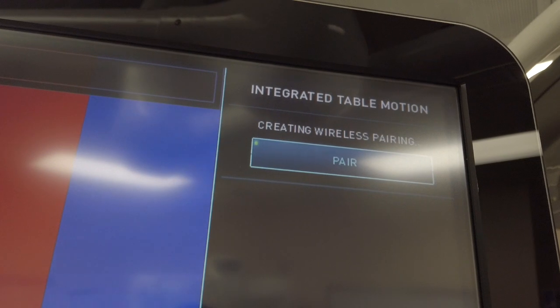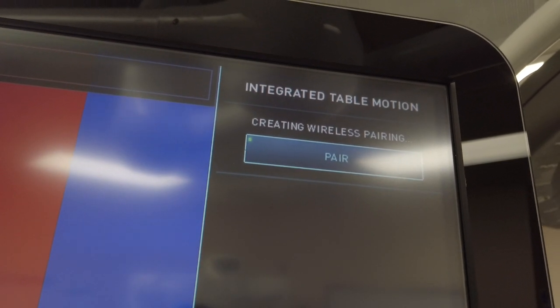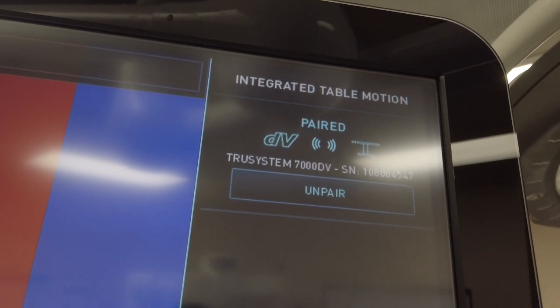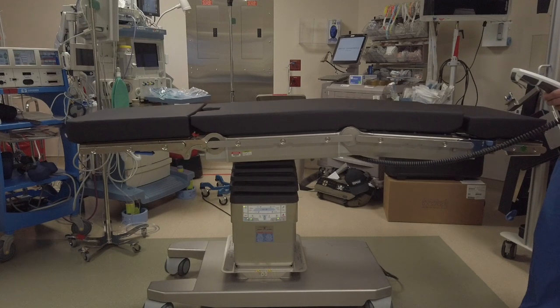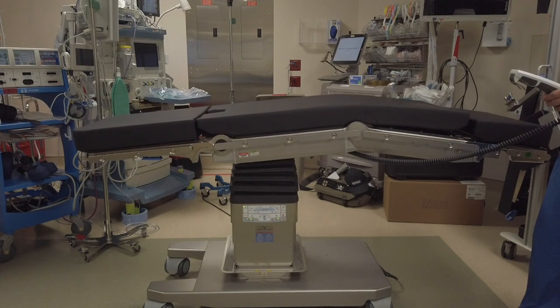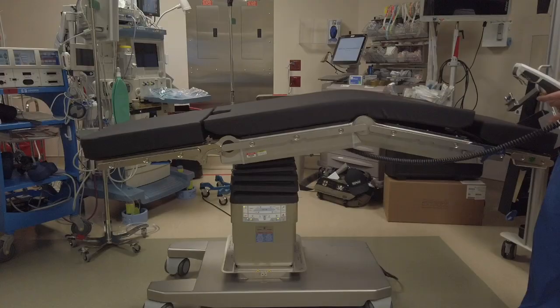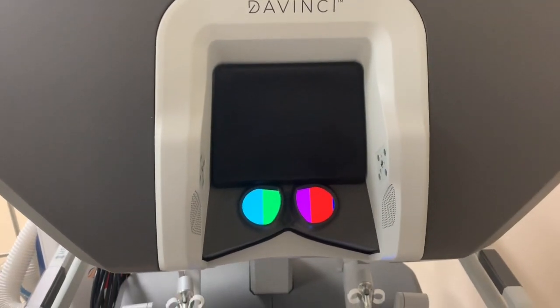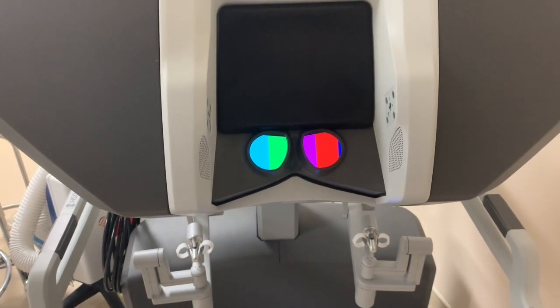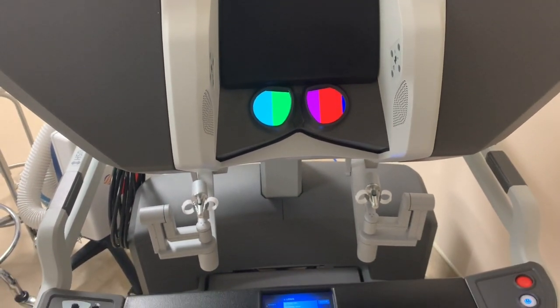Position the patient as usual and begin inserting the instruments. Once the first instrument is inserted, the hand control should go dark, disabling the controls until the case is over and instruments are removed. If during the procedure the surgeon decides that they want to reposition the table, first anesthesia must confirm that the surgeon, number 1, is actively controlling the hand controls, number 2, has their head in the viewfinder, and number 3, has all instruments in the field of view.